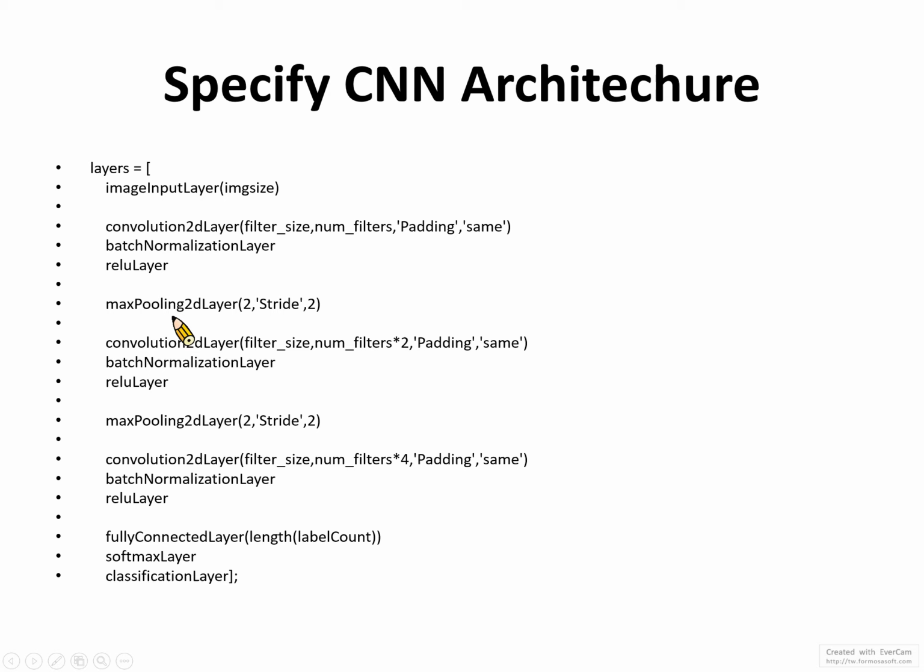Of course, if you need to improve the model, you need to design your own CNN model. For example, you can add more convolution layers, or you can try to develop a more complex architecture, just like ResNet or AlexNet. That is another topic of the workshop, but I will not show you this time; I will show you in the next course. But for now, you should be able to follow this simple convolutional neural network to do the deep learning classifications.